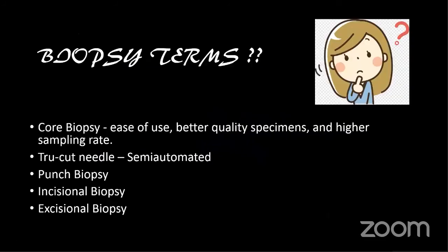Now coming to the most important section of breast interventions, which is the biopsies. Biopsies are very important these days because whenever we detect a lesion in the breast, we have to, of course, rule out whether it is malignant or whether it is not. Now there are some confusing biopsy terms which might not be clear in the initial start of your practice. What is core biopsy? What is true cut biopsy? We keep on hearing different names. Then we have punch biopsies, incisional and excisional biopsies.